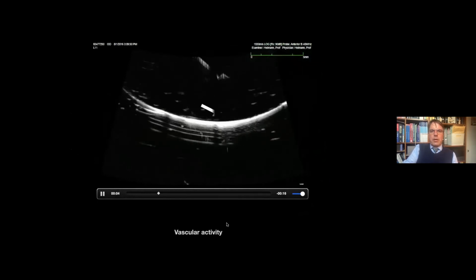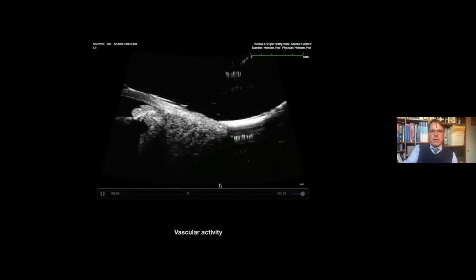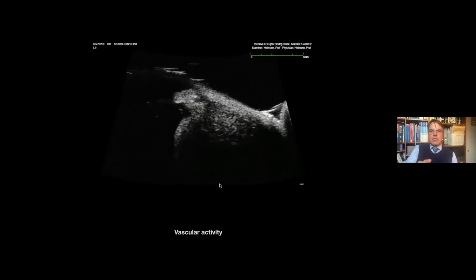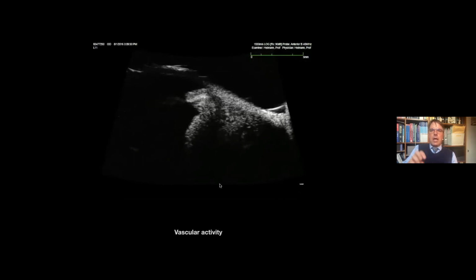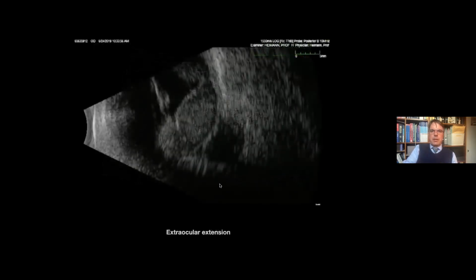And if you look very closely, you can see like a motorway of blood cells shooting through really in the middle. If you can see that now, really like an injection of ink. So this is a high vascularization, meaning this tumor has lots and lots of blood vessels in it. And this is typical for melanoma. So in that location, you sometimes cannot tell, is it a bleeding or what is it? And if you see these blood vessel pulsations, that's typical for a melanoma on the ultrasound scan.